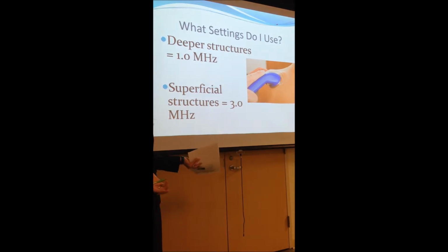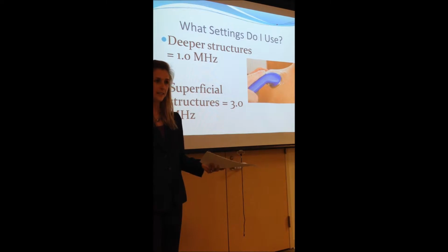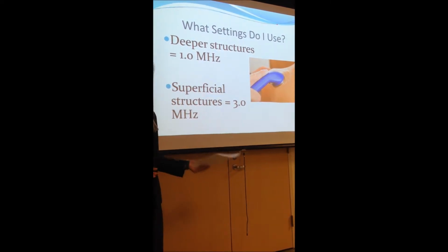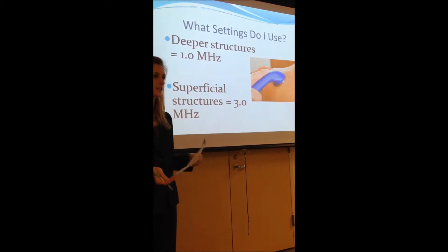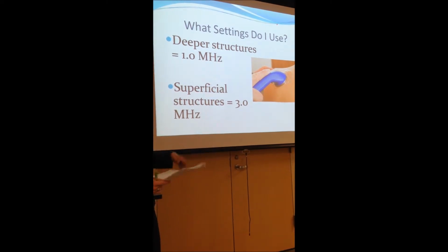So what settings do we use? PTs will write down the settings in their plan of care and PTAs will carry it out. But if a patient asks you a question about this, we all need to be on the same page and understand why we're choosing the settings that we are choosing. Generally, deeper structures are 1 megahertz, and more superficial structures will be 3 megahertz.